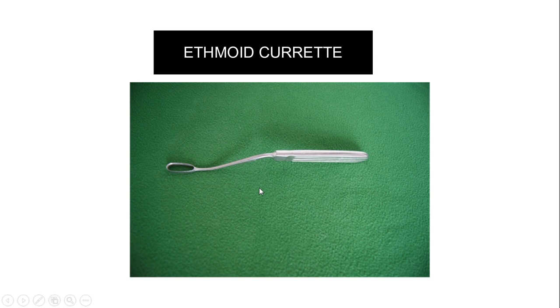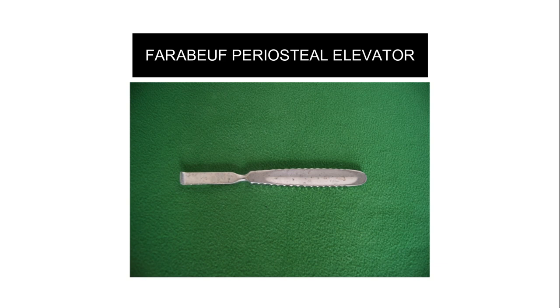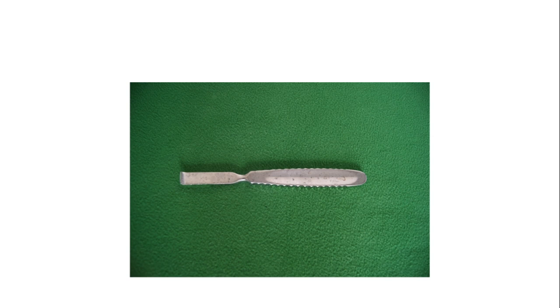This is the ethmoid curette, used in ethmoidectomy. This is the Farabeuf periosteal elevator, used to elevate the periosteum — for example in mastoidectomy.